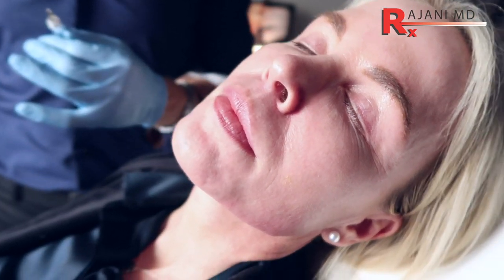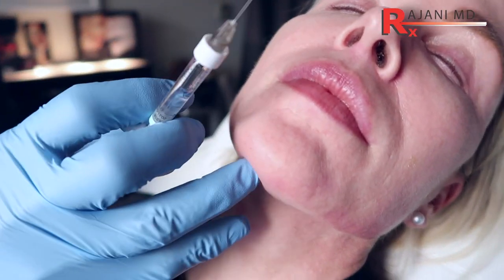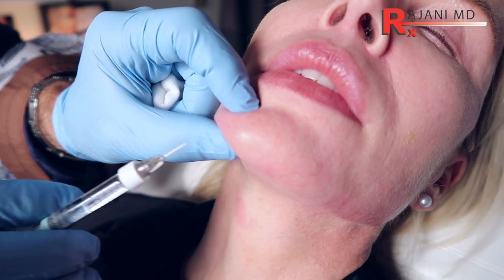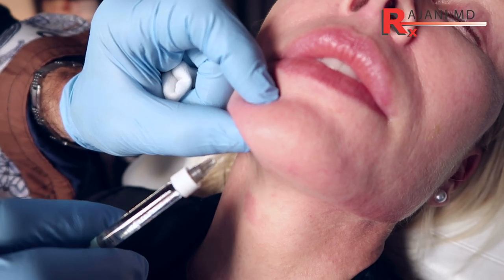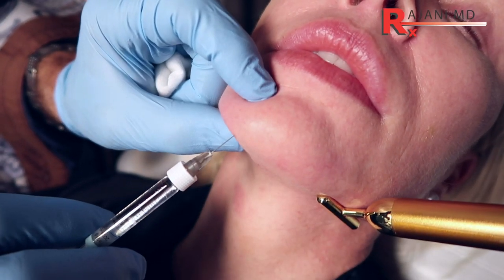So what we're going to do is this: for the mental area, we're going to use Restylane Lift because it's strong and doesn't integrate with the tissue as well as expression technology. When I'm holding like this, I can feel the mentalis here and I can feel the bone. So I'm going to go in between — one injection point and two — to bring it forward.